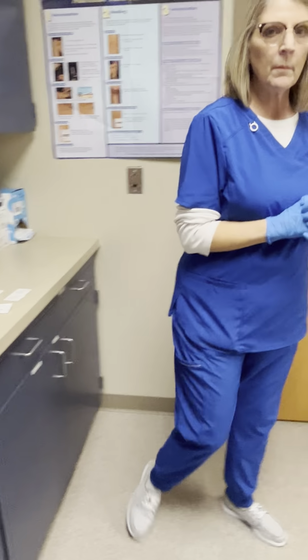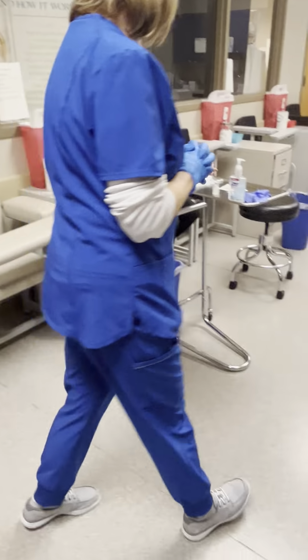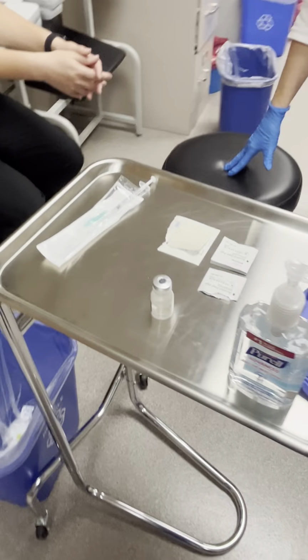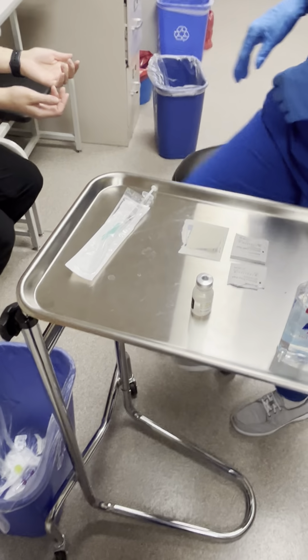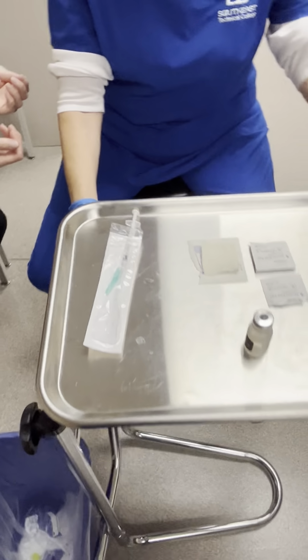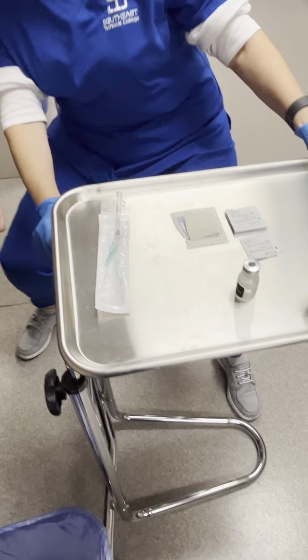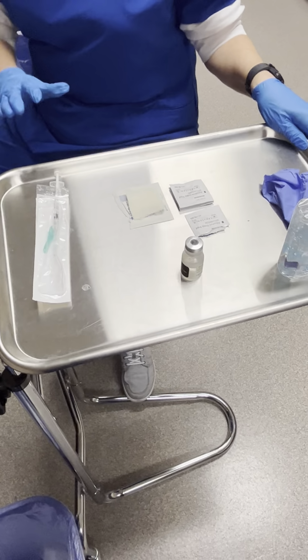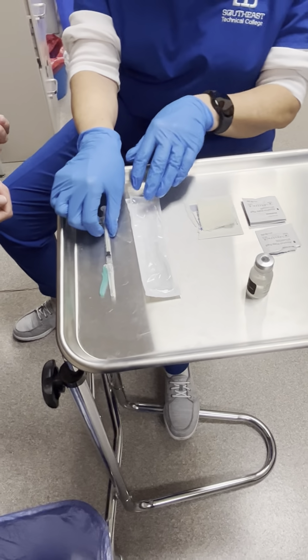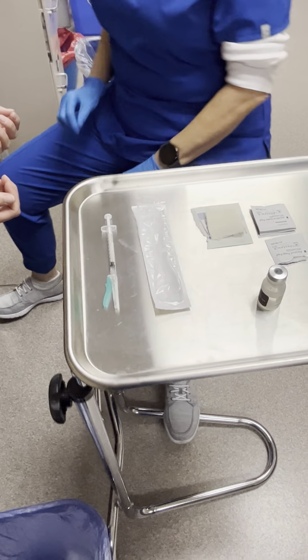So we are going to come over here today to the table for our demonstration, and this is Lindsay. Lindsay is my instructor, and she's going to be my patient today. We have all of our supplies laid out here and ready to go. For the purposes of our video today, I've already drawn up my TB syringe, and it'll be ready to go.